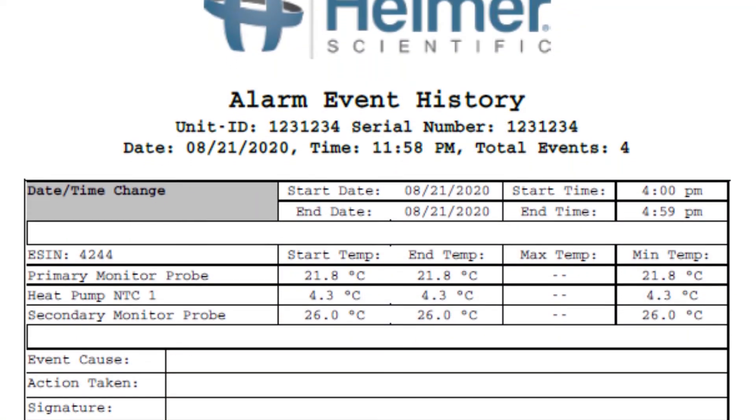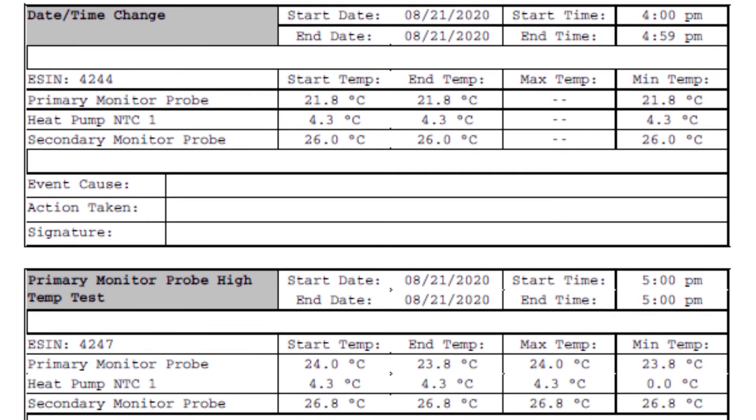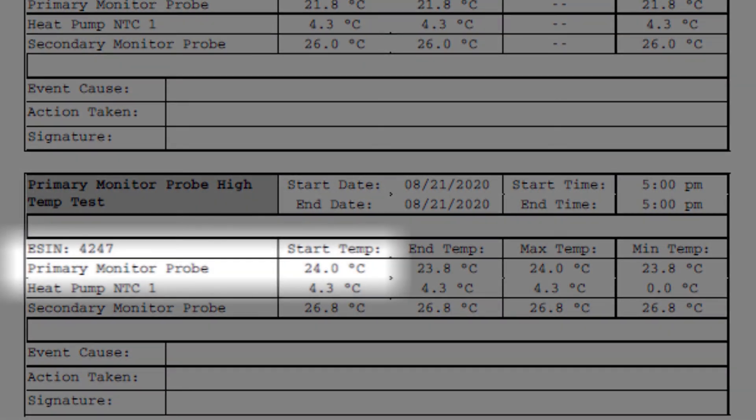Automatic Alarm Testing can be used to meet the College of American Pathologists' Transfusion Medicine Checklist requirements by clearly showing the temperature at which the alarm sounded during the test.